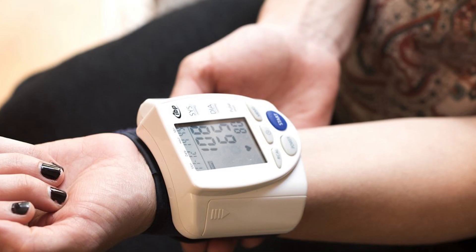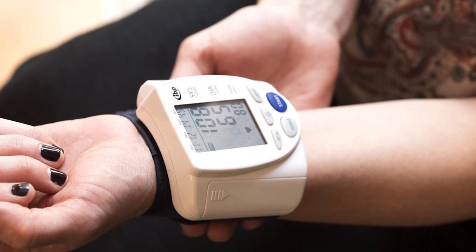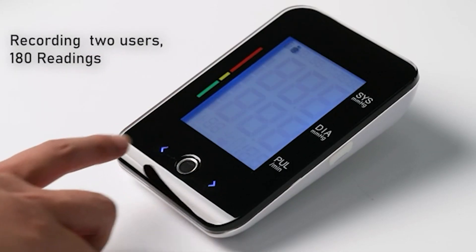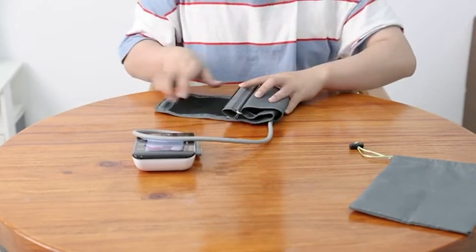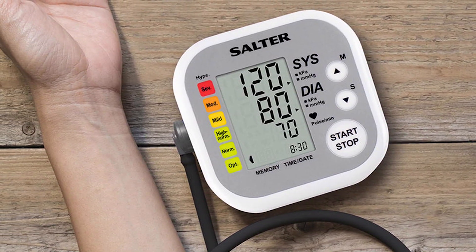Wrist monitors are also very responsive to body positions, and your hands tend to move around more than your upper arms. Plus, it's more difficult to raise and maintain your hands at the level of your heart versus your upper arm. That being said, some people find it uncomfortable and even painful to get their blood pressure measured at their bicep, especially if they have large arms. In these cases, a wrist monitor might be a better choice.